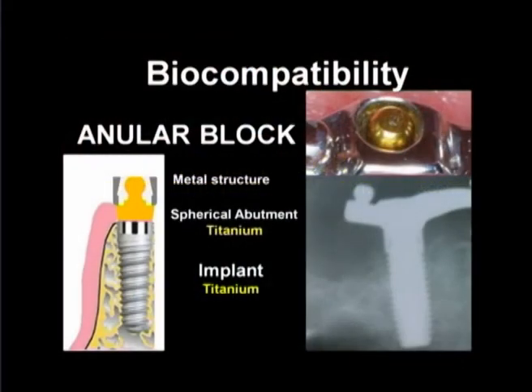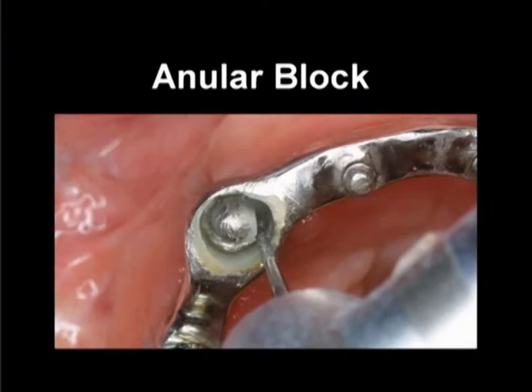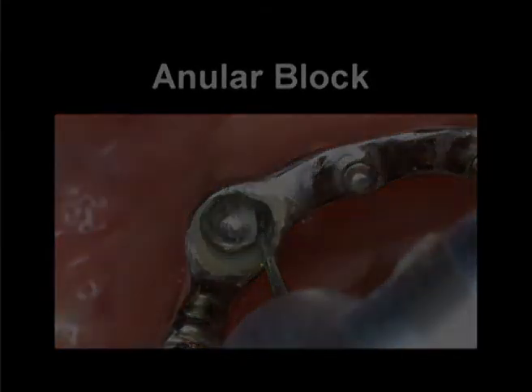Connection between fixture and abutment will always be a titanium to titanium one. For casting of the bar and annular blocks, any other metal alloys may be used. If needed, to remove an annular block bar, you just grind out the composite linking the rings and the spheres. Even if some surrounding metallic parts are touched by the drill, don't worry. They will work as a retentive undercut for the next composite curing sessions.